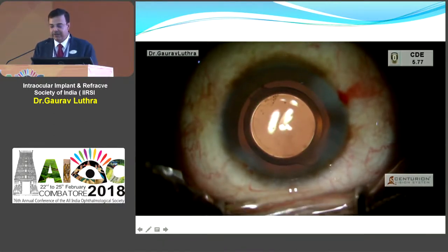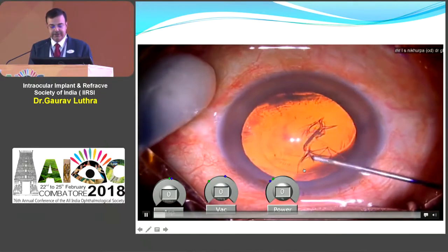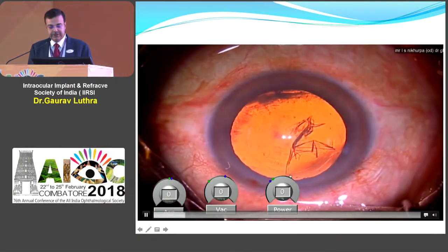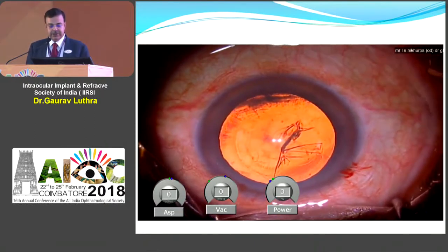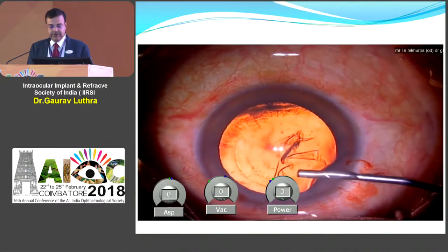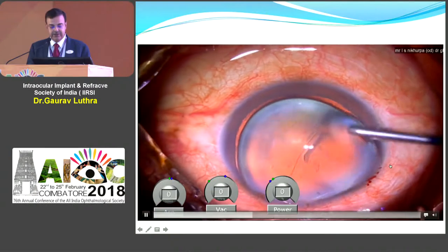Now let's see a few situations where you can have problems with the rhexis. Here we were making a rhexis and it suddenly started running out almost to the edge of the pupil. You can see the rhexis running out — immediately go back, put viscoelastic, and make sure that your chamber is not shallowing. Then you can go in with a micro-rhexis forceps or a similar instrument to try and recover it.